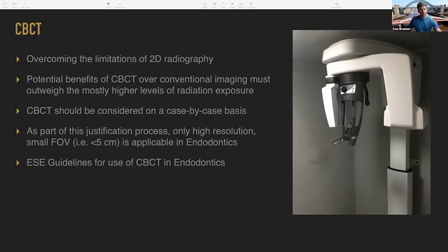But before considering a surgery, you certainly want to be taking a cone beam. Cone beams are going to be used more and more, especially because we can get the field size down to 4x4, 5x5 cones, and we can reduce the parameters, so we've got a high-resolution, small field of view that you're going to see a lot for endodontics.